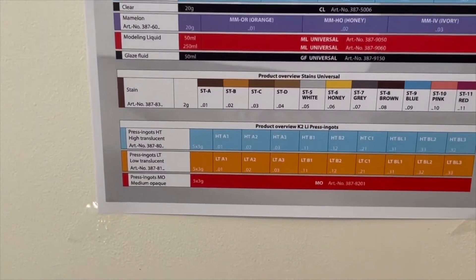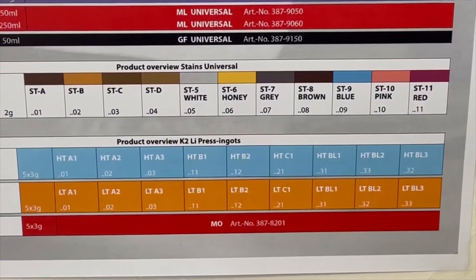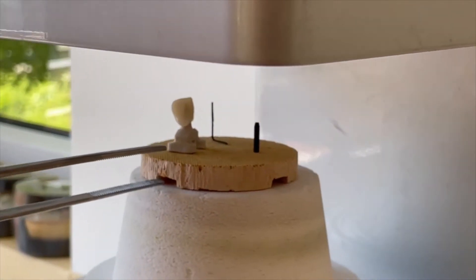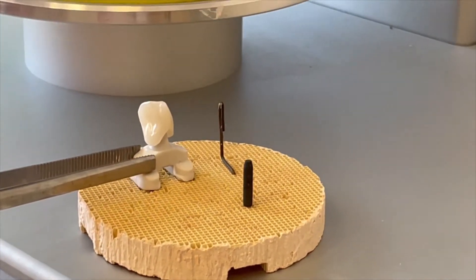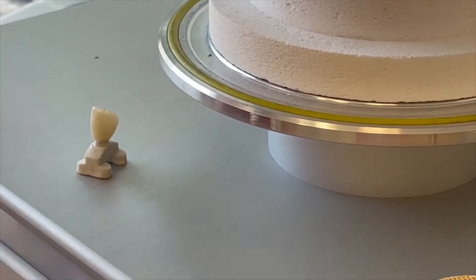What I forgot to mention before: you can also have lithium press ingots, which are very helpful for the monolithic system or for the cutback technique. During this time the ceramic crown will be ready. It is coming back from the furnace and as Andrea takes it out — it looks great, it looks great! She will set it on the model. It is still a little bit warm and Andrea shows me the result.